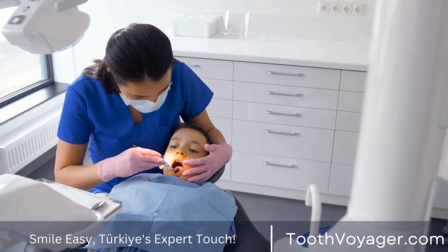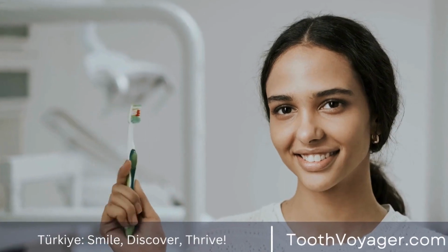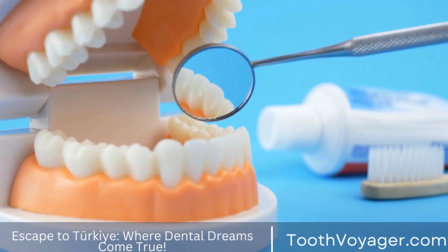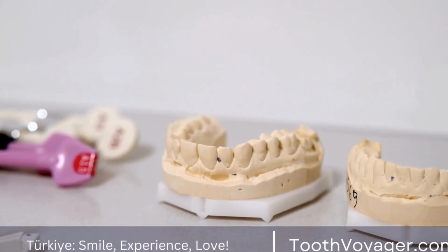6. Restoration. The final stage of the procedure of dental implants is attaching the dental crown to the abutment. It could include a bridge, crown, or a denture, depending on the quantity of missing teeth as well as the individual needs of the patient. It is made to fit the shade, size, and contour of a patient's teeth. It gives an extremely attractive and practical smile.